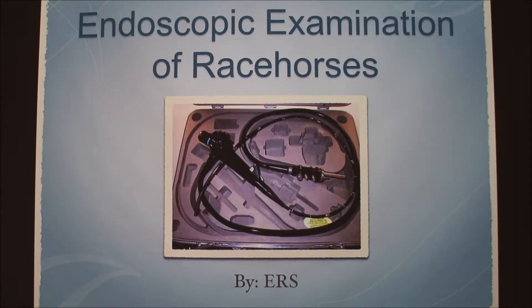My topic is over endoscopic examination of racehorses. I'm going to go over the parts of the scope. This is the part where the vet looks through. These knobs can turn the tip of the scope left and right and up and down. The actual camera is right down here, and this tube is fed by hand through the horse's nose down into their trachea. This part is where you attach a light source so you can see.